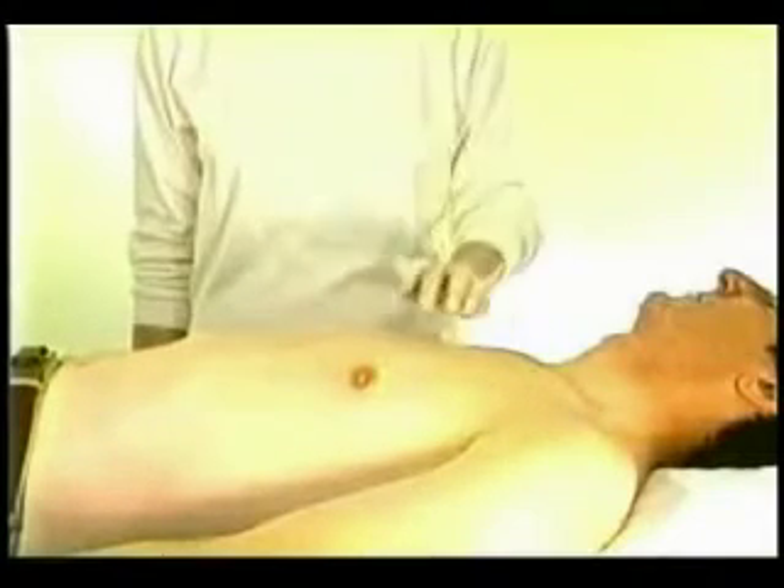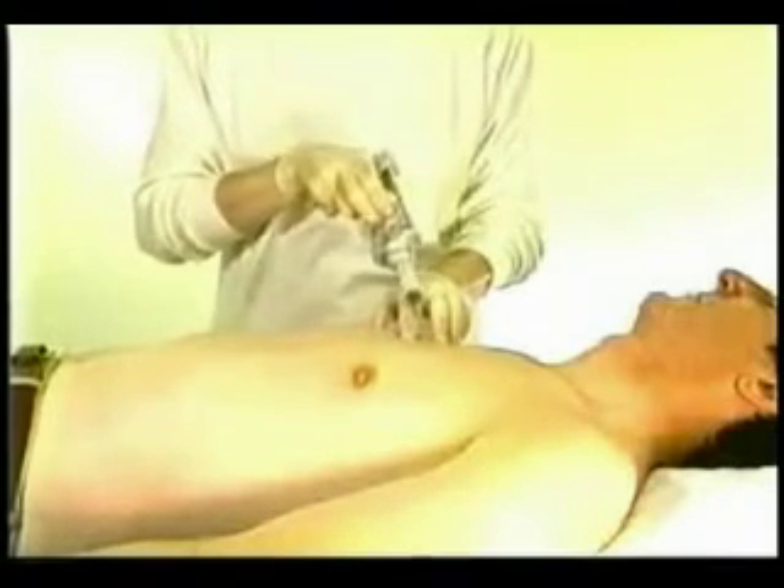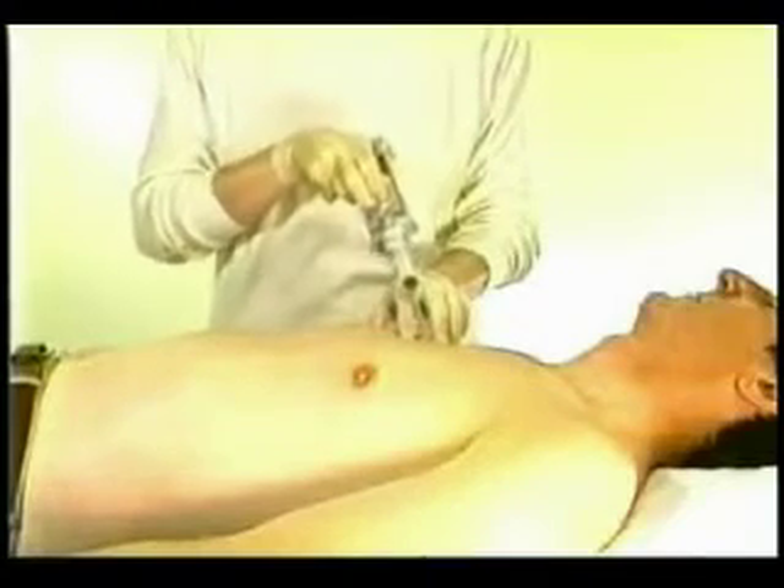I always do a second sample of any one target in order to ensure enough material and also to sample more than one area in a large target. The second sample is more likely to contain blood than the first one, because of the trauma of the first sampling.